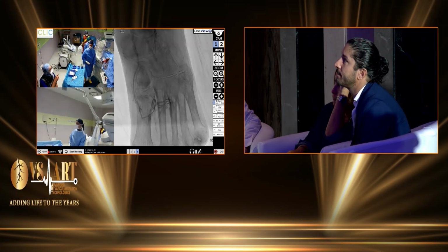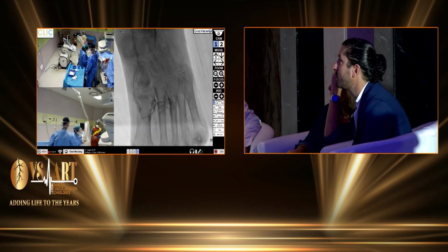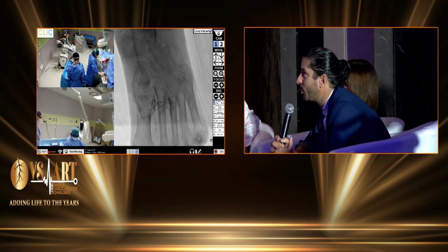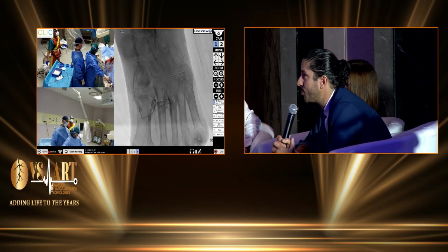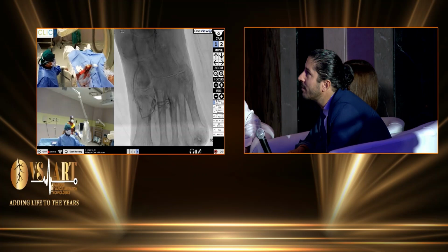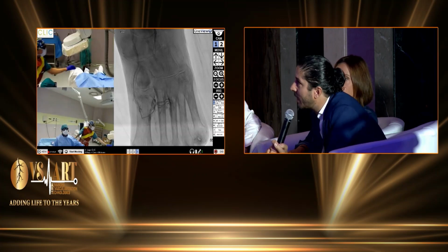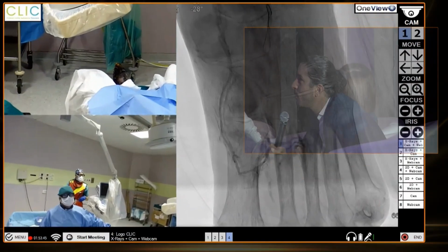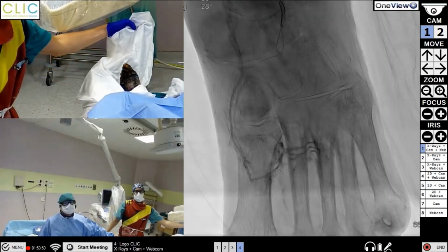My concern. Is it possible to see the foot, please? Mariano, the foot is terrible. Yeah, I can imagine from what I was able to see in the angio. I was expecting something like you are going to show us. We have a mummy here. Unfortunately the camera is not able. Ah, good. I was thinking it was on the floor, but it's the foot. Yeah, fantastic. Super.